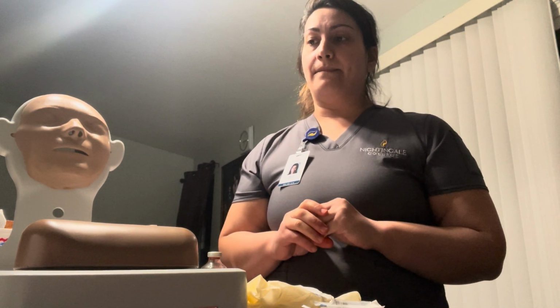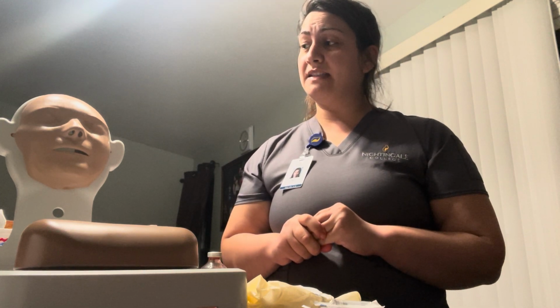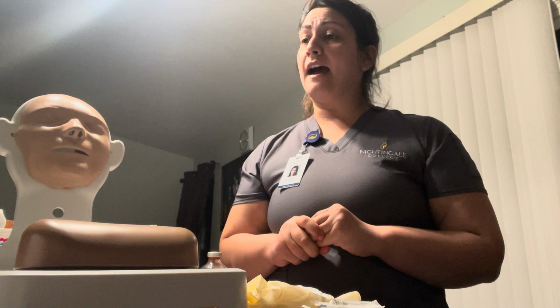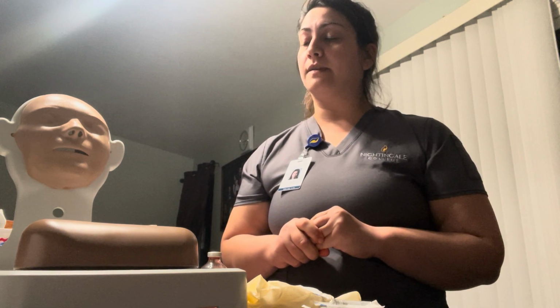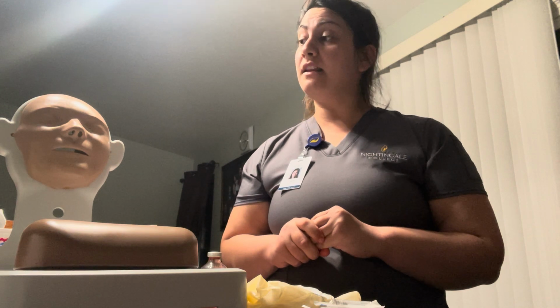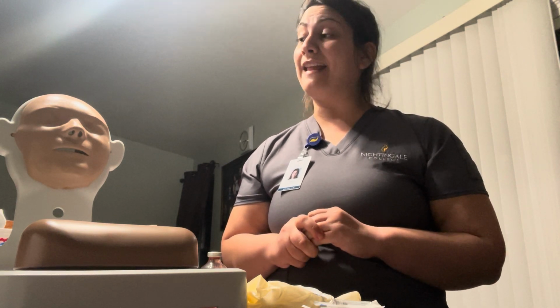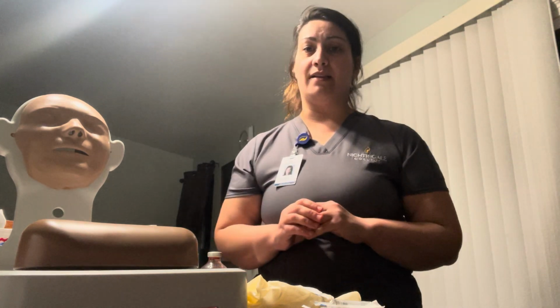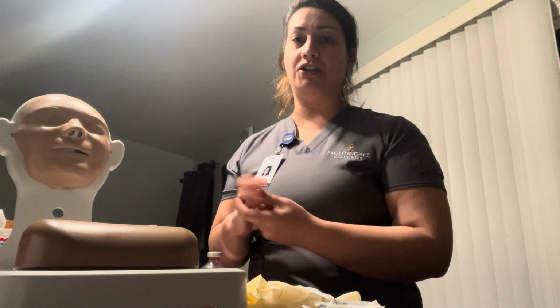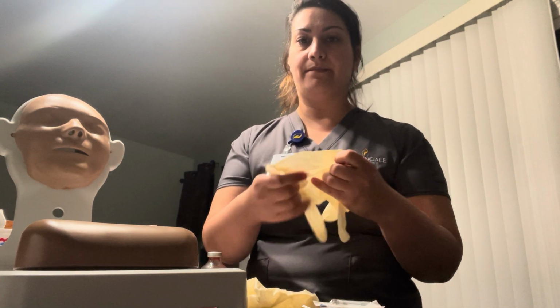Next, I'm going to ask my patient, do you have any questions, Ms. Smith? No? Okay, I just want to let you know that before I start the injection, you will feel a little burning and you're going to feel a little poke, and that is normal, okay? All right, so now that I have told her everything about the medication, I'm going to do hand hygiene, and I will put on my clean gloves.